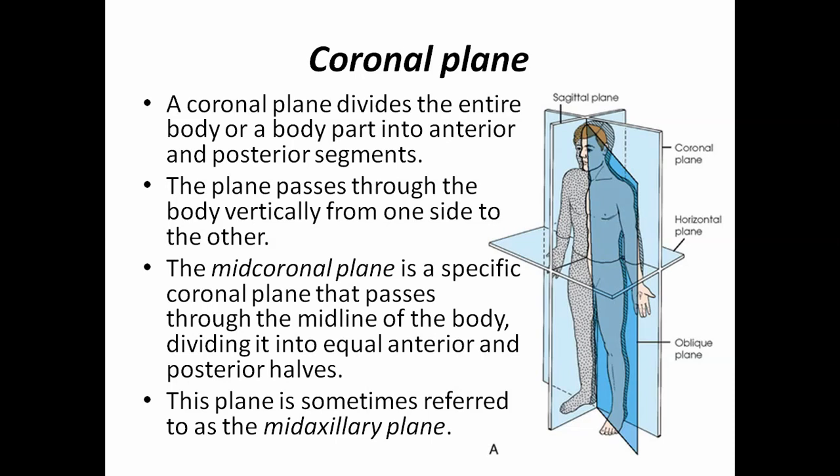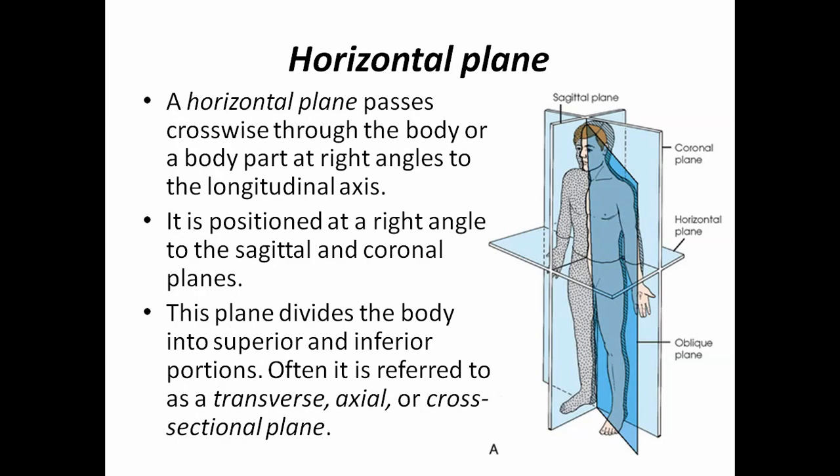In certain radiography, for example the left lateral chest X-ray, we will say that the axillary line should be perpendicular to the cassette, or perpendicular to the table or vertical bucky. So axillary plane and coronal plane have a similar meaning.